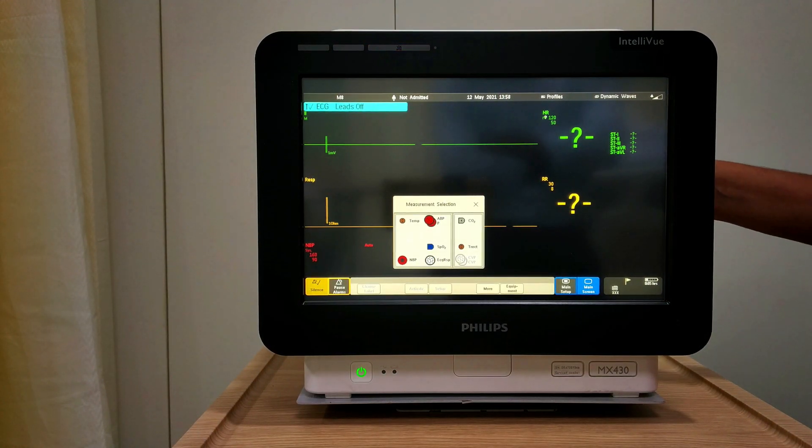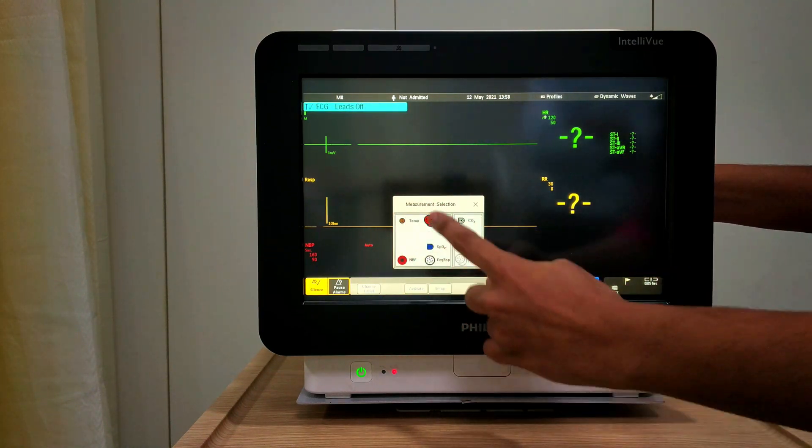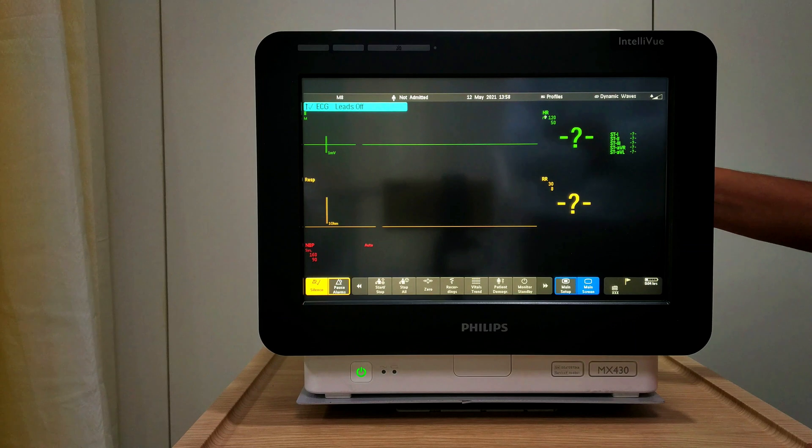Once the monitor is on, you can see my servers got detected — my MMS server and extension server. This monitor is a touchscreen.